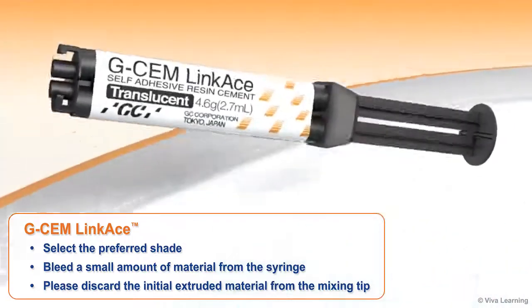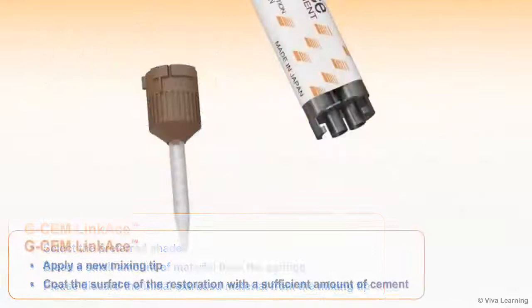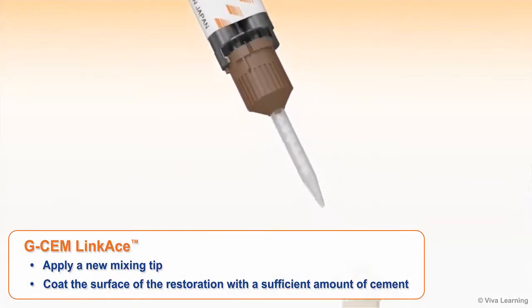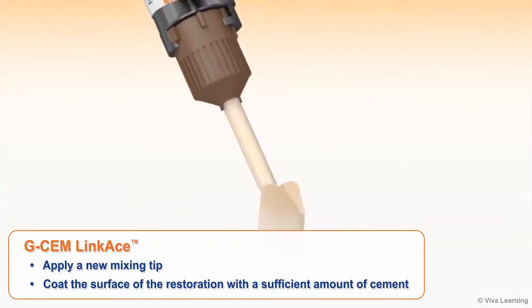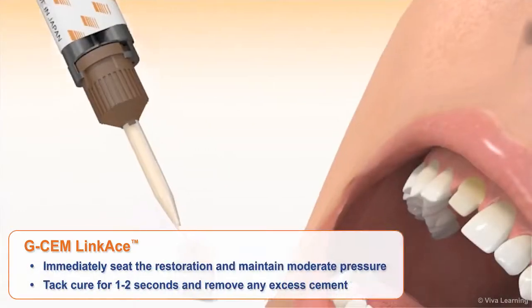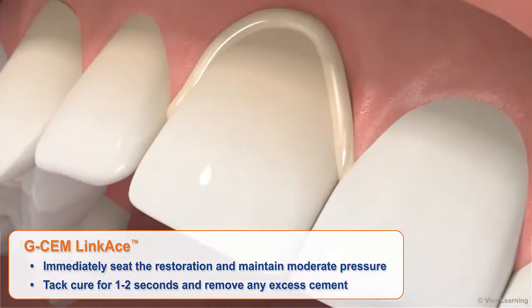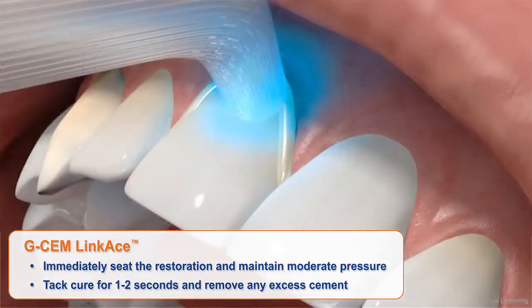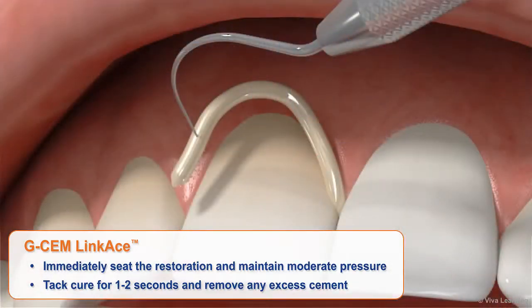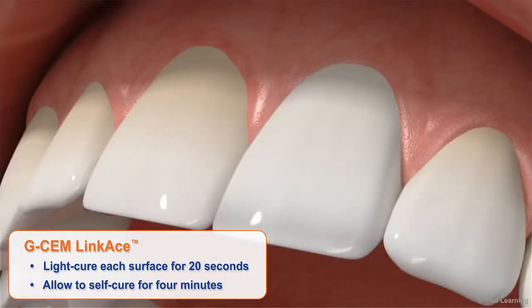Select the preferred shade and bleed a small amount of material from the syringe. Apply a new mixing tip and coat the surface of the restoration with a sufficient amount of cement. Immediately seat the restoration and maintain moderate pressure. Tack cure for 1 to 2 seconds and remove any excess cement. Then light cure each surface for 20 seconds and then allow to self-cure for 4 minutes.